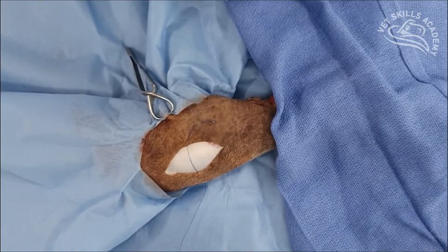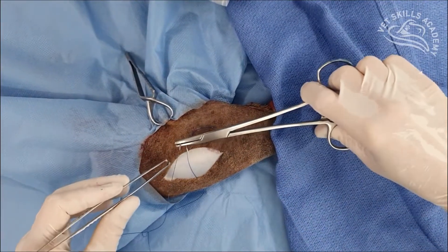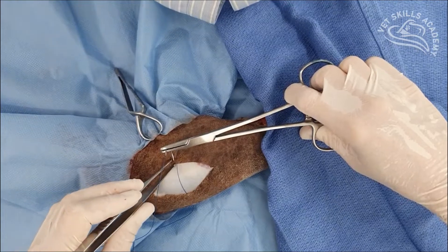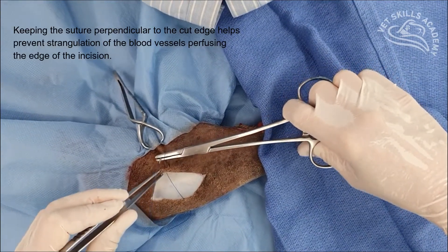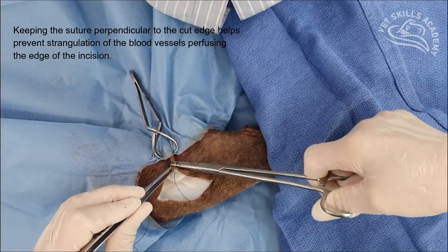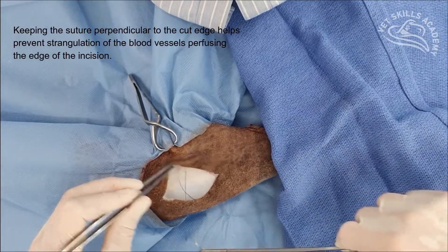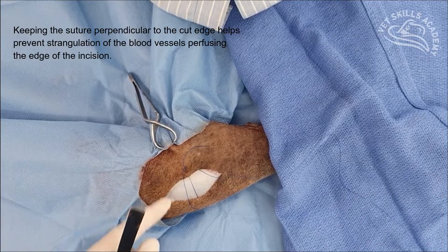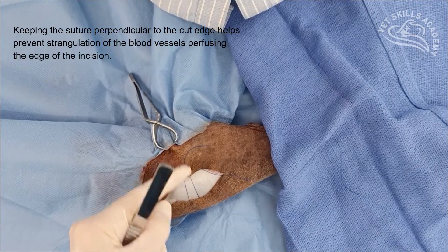Our next bite is far, so we come across to the opposite side, staying in a line that is perpendicular to the cut incision. We're going far, right through the dermis. It's not going through easily because it's not a cutting needle. So we've got near, far — now we've done the far component.